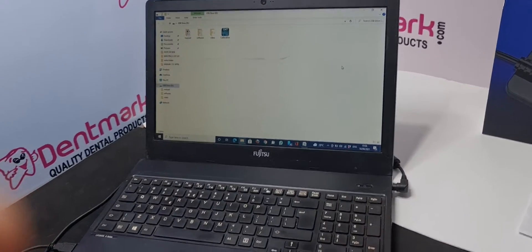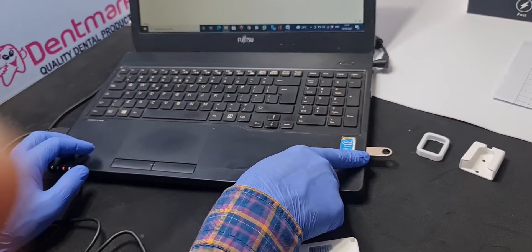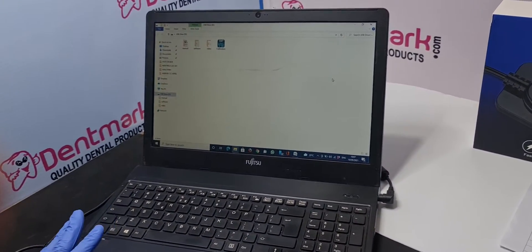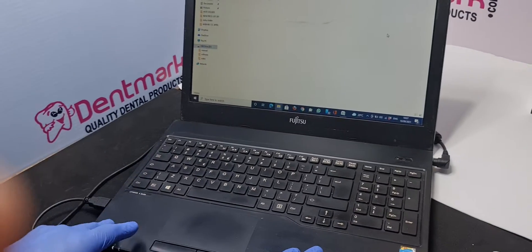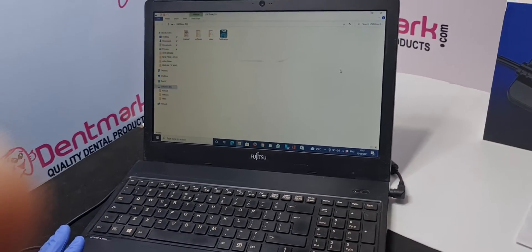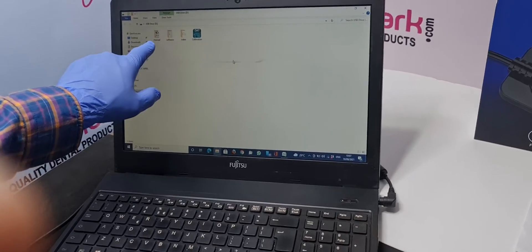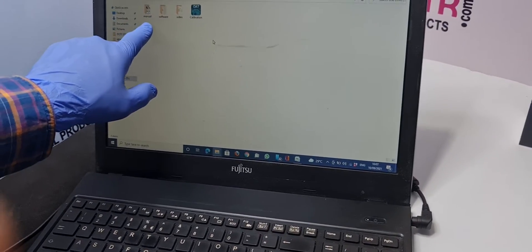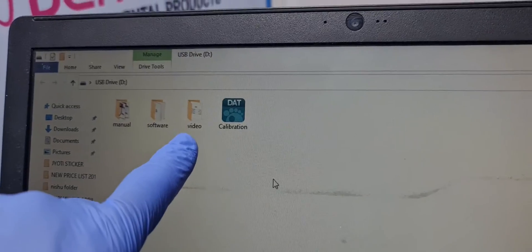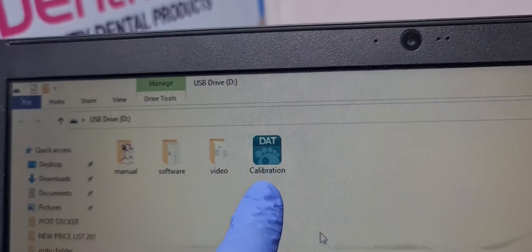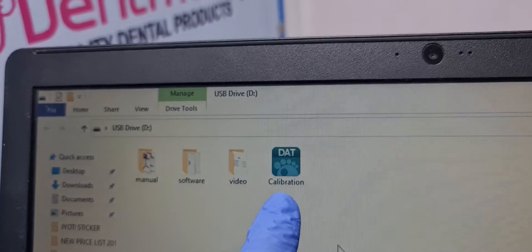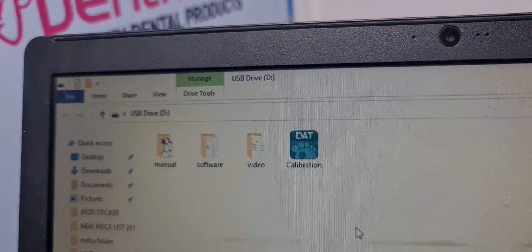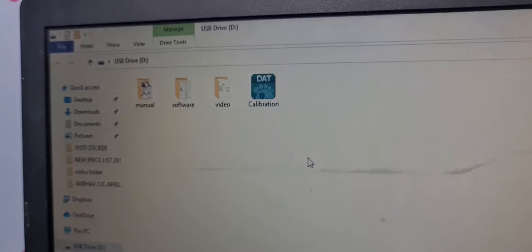So attach the USB disk to the laptop. Your laptop or PC should be the minimum requirement is i3 with minimum 4GB of RAM. You can see in the disk there is a manual if you want to read yourself, the software, video and calibration file. Calibration is of two types, one is automatic calibration through software and one is a manual with the aluminum plate through X-ray.